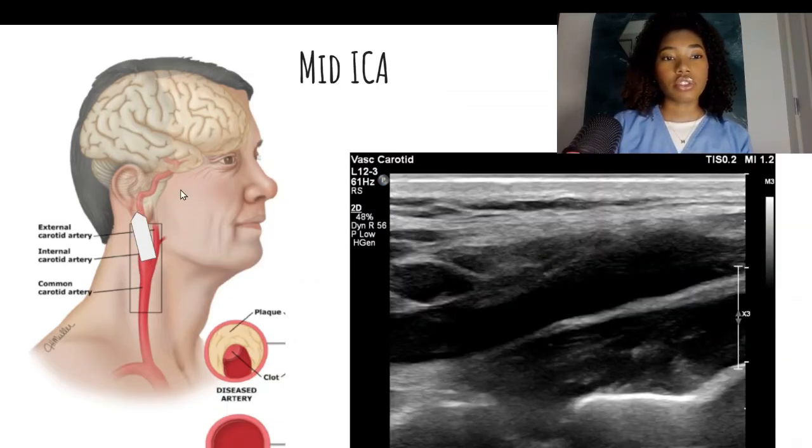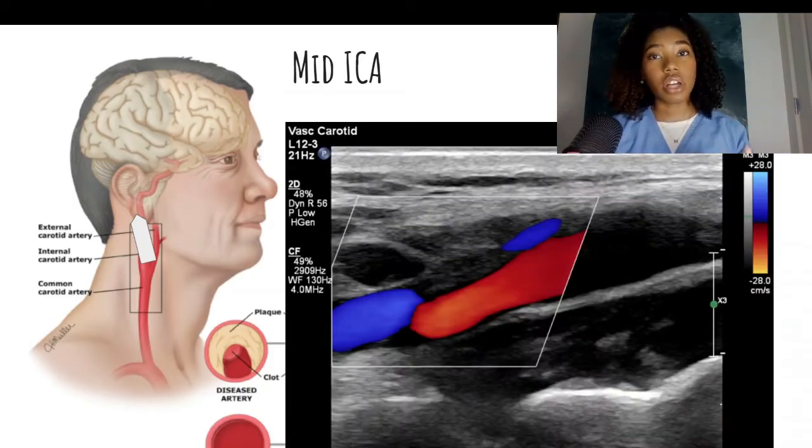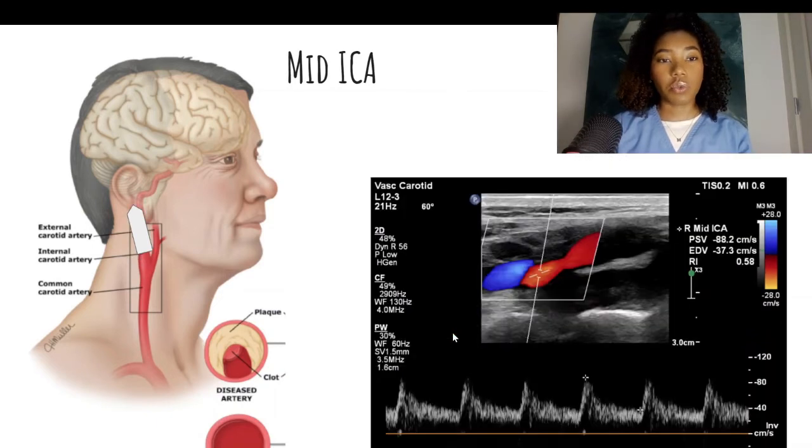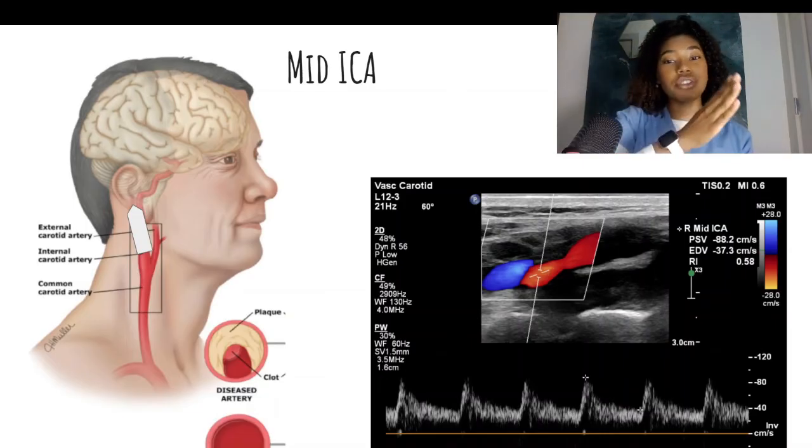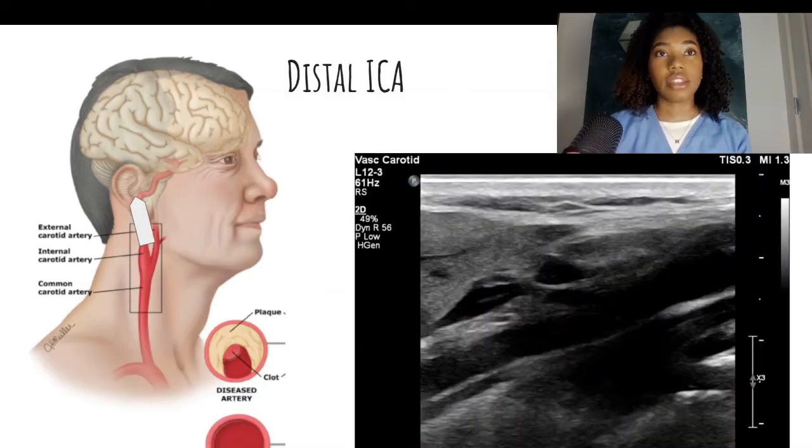Next, we'll move superiorly on the neck to the mid-internal carotid artery and take 2D, color, and pulse wave Doppler. For the mid ICA, as you see in this transducer diagram, you will have to angle a little bit because the direction of the internal carotid artery will be changing — it will be coursing more posterior and it might be turning at the same time.